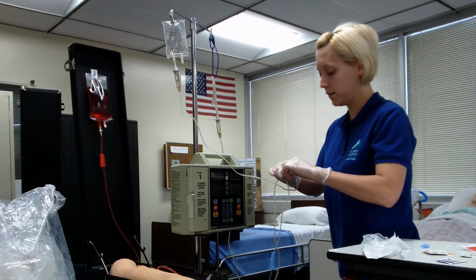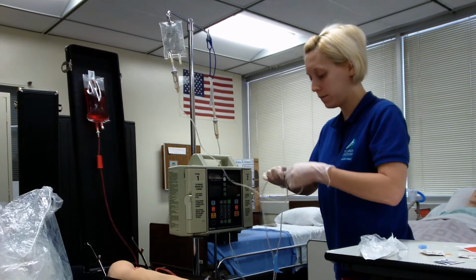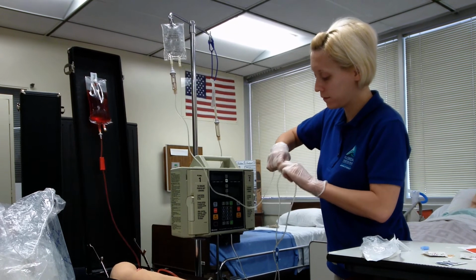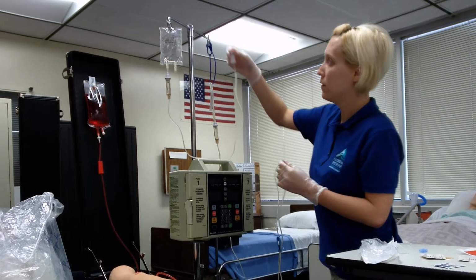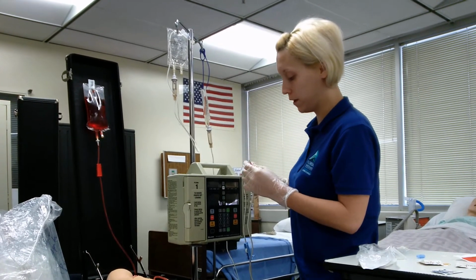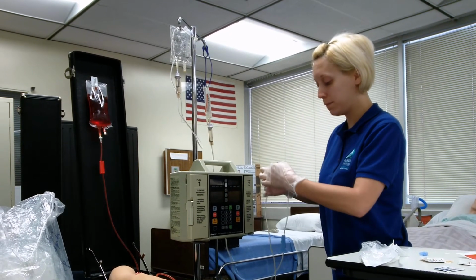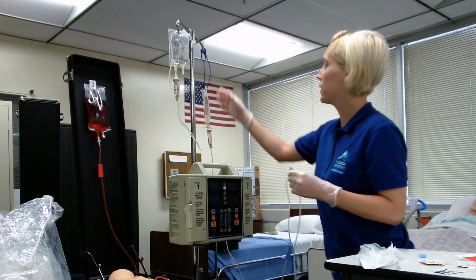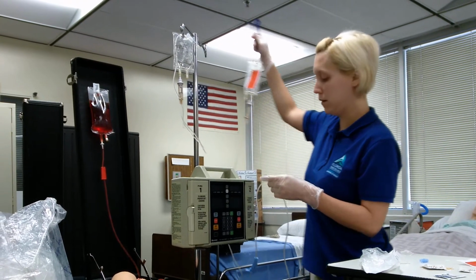I'm going to take that off. I would dispose of that properly according to the policy. I'm going to put this back up.